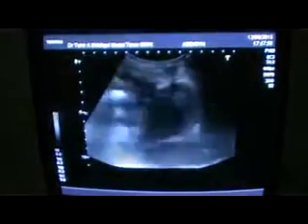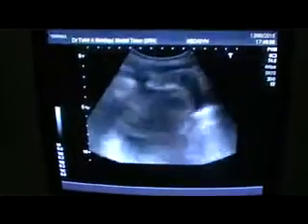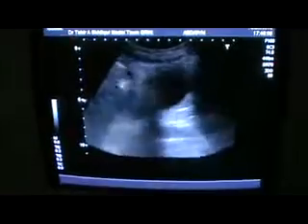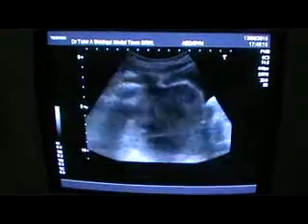Well, this is the pelvic study of a 35-year-old female, in which I am showing you the pelvic region. This is the urinary bladder. This is the transverse section of the urinary bladder. This is the longitudinal section.